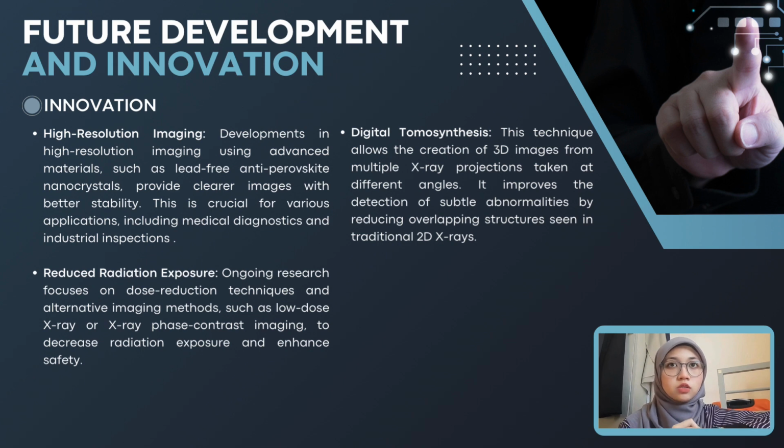So for the next part, which is the innovation, I also put three ideas. The first one is high resolution imaging. With developments in high resolution imaging using advanced materials such as lead-free antiperovskite nanocrystals, it will provide a clearer image with better stability. This is crucial for various applications including medical diagnostics and industrial inspections.